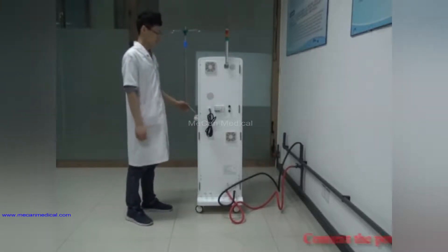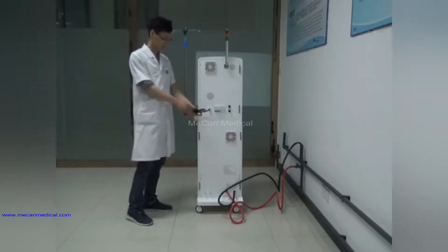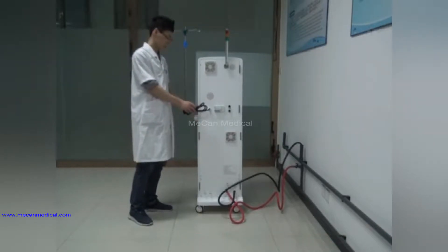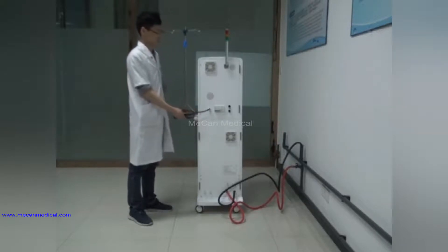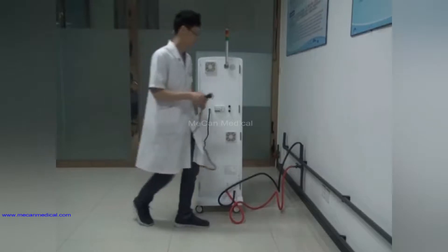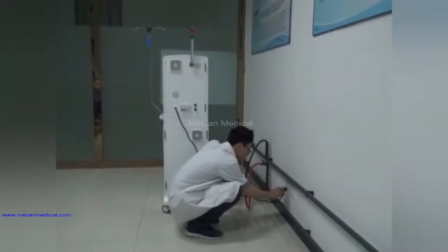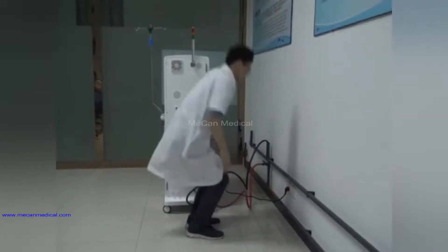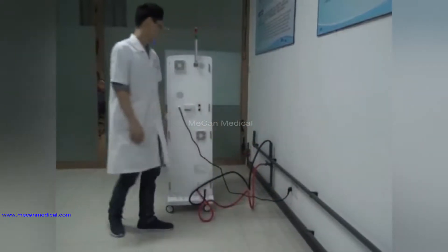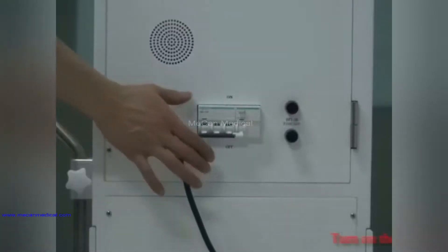Now we connect the power line. Turn on the switch.